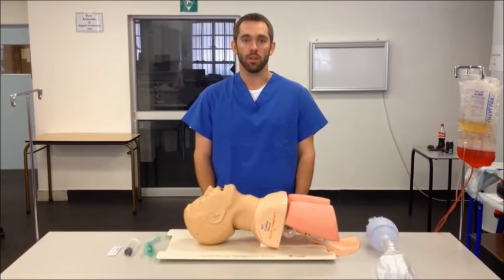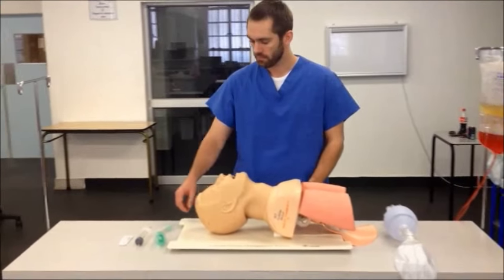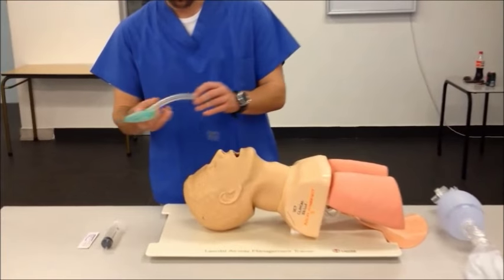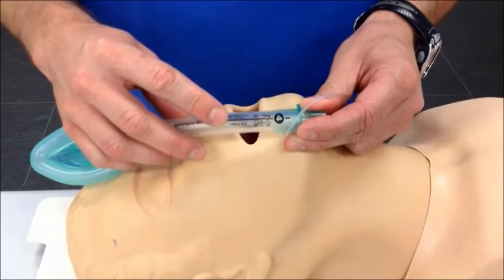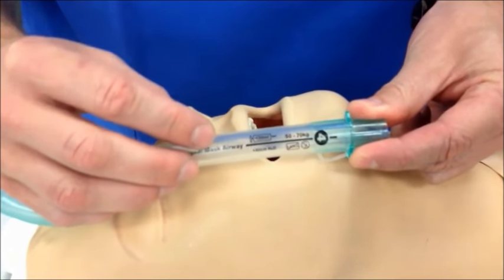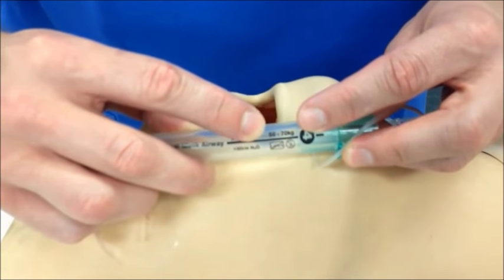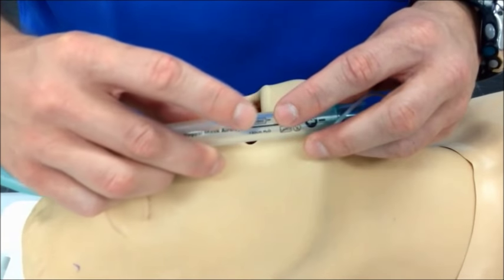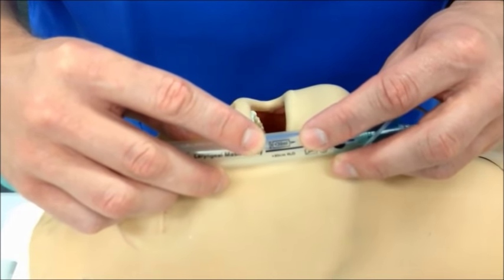The first step in using an LMA correctly is to select the correct size. Sizing of laryngeal mask airways are manufacturer specific, and the instructions will usually be printed on the tube itself. In this case, we can see that it would be appropriate for an adult weighing between 50 and 70 kg, and that the amount of air needed to inflate the LMA cuff is 30 ml of air.